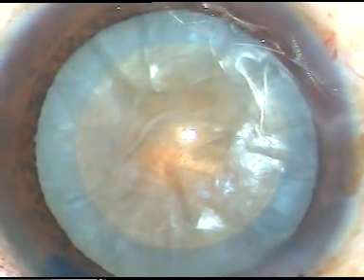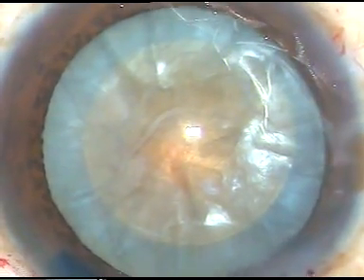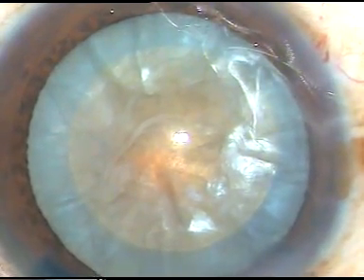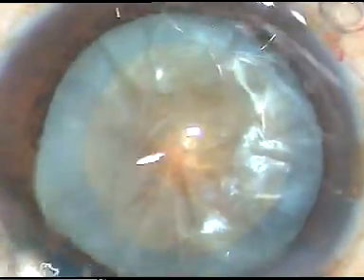We can see that this is a white cataract. Capsulorexis has been done and now the tip of the phaco handpiece is being introduced into the anterior chamber. Now let us see how the nucleus is being managed.